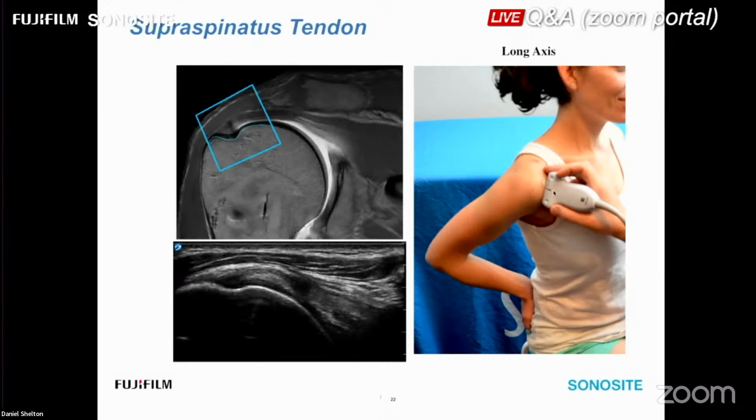We've rotated the probe 90 degrees to a longitudinal plane to the supraspinatus. This is a coronal body plane, and then we're going to be panning the probe lateral and medial. We're looking at the humeral head to be rounded and the greater tuberosity to have this kind of parrot's beak. As I mentioned, the difference between the subscapularis and the supraspinatus is a cortical landmark that I discussed last week at the anterior shoulder demo: a subscapularis, while it looks very similar, has a very flat beak. So it's a bird's beak. This is a parrot's beak. It has a hooked bill. If you want to get nerdy about how you remember these things, that's one way to do it.